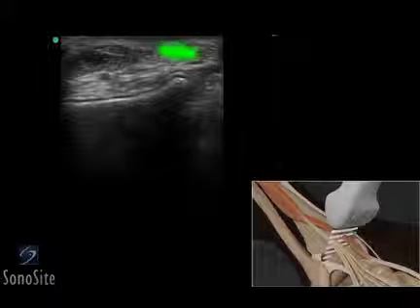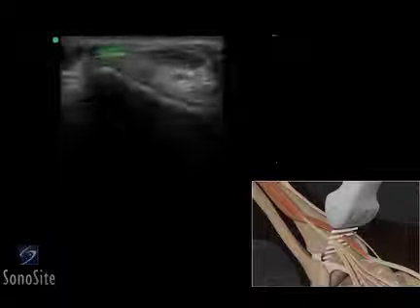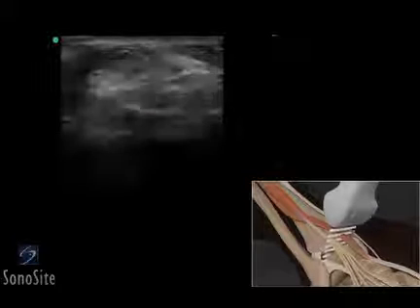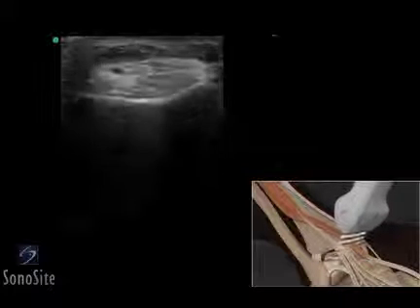The anterior tibial tendon is most medial. The extensor hallucis longus tendon is next to the tibial tendon. The extensor digitorum longus tendon is the most lateral tendon in the group. The tendons should be scanned superiorly and inferiorly to evaluate for tears or tendinopathy.